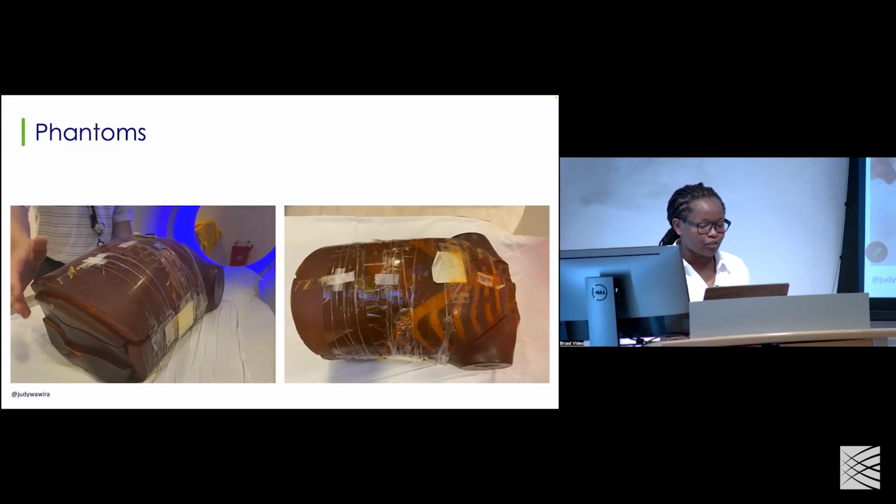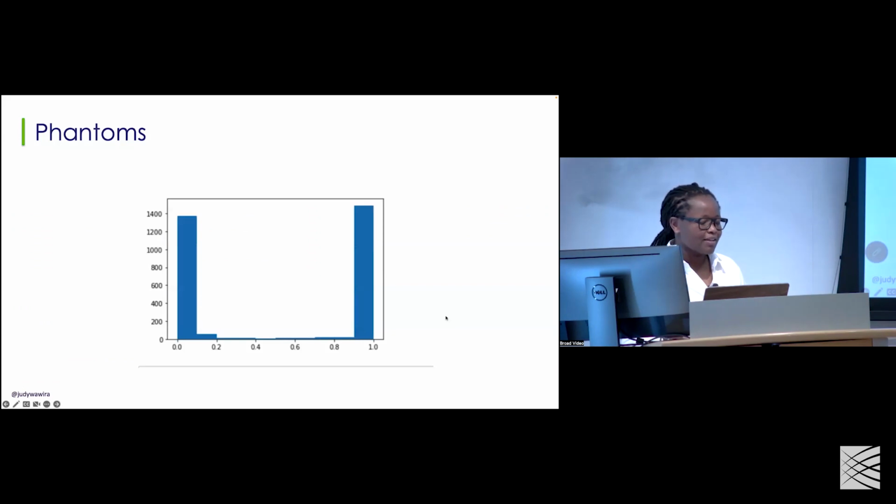So I invoked our physicists, and we went and scanned this using very specific protocols because, as we've learned from other areas, for example, the pulse oximeter, the temperature gauge, which we know varies a lot with skin tone, we do also have to look at the equipment and see why that matters. And what was surprising is that this is just one spectrum of one same patient. On one end, it believes this patient is Black, and on the other end, it believes this patient is white.